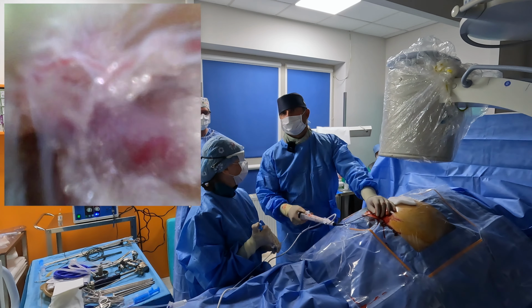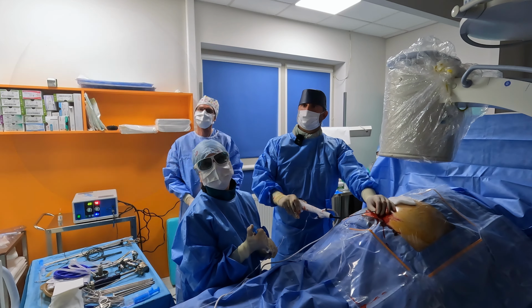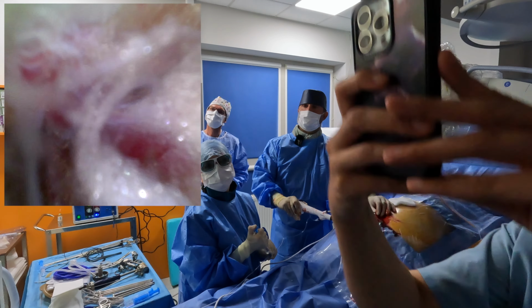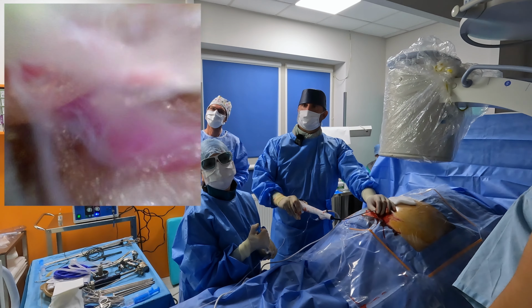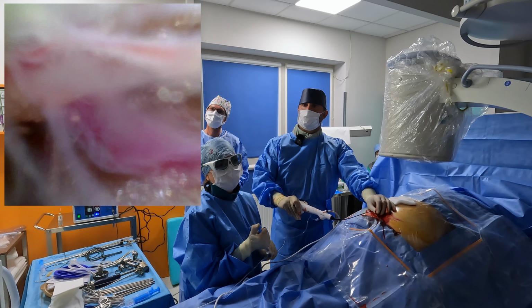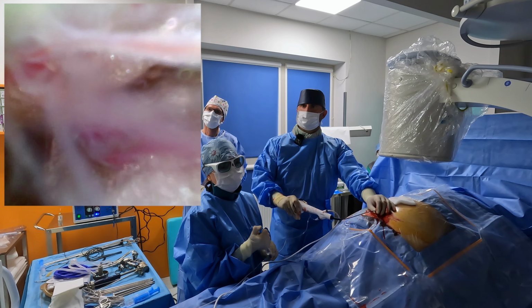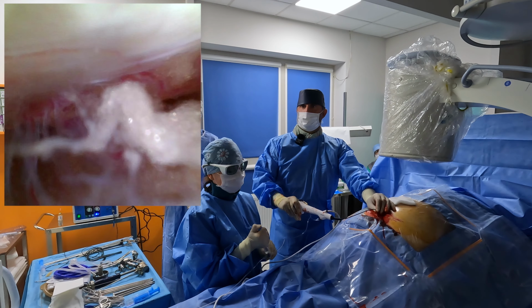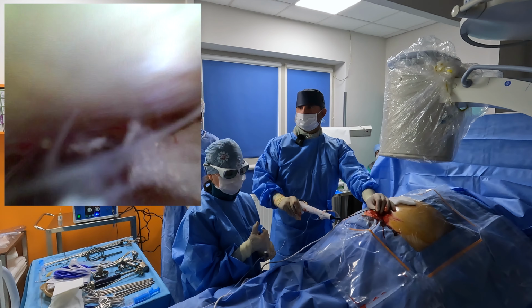So here we are at the level. You see a beautiful picture of something like a varicose vein at the epidural space, which also means there is some pathology. So the blood vessel there is significantly wider than it's supposed to be, and it's just giving the information that something at this level is wrong. We see dura above. We see a very nice picture of the epidural space at this level.